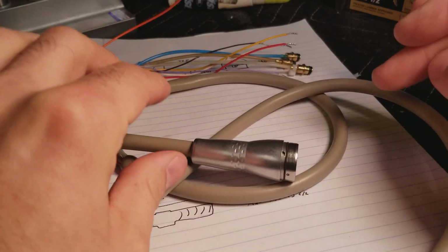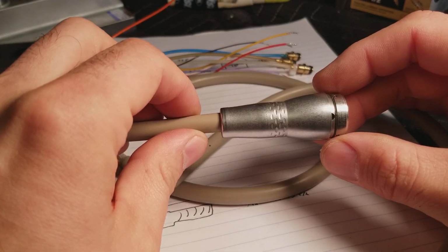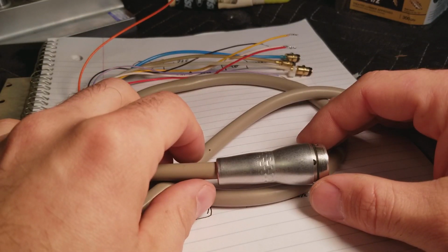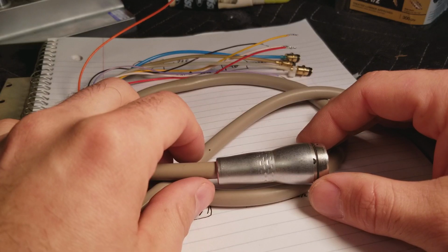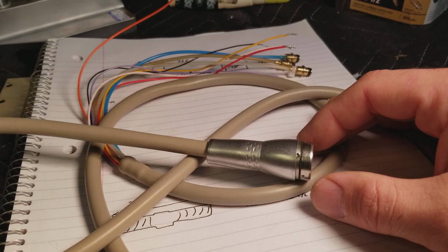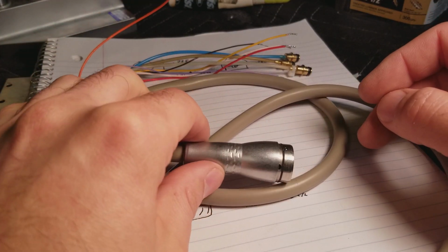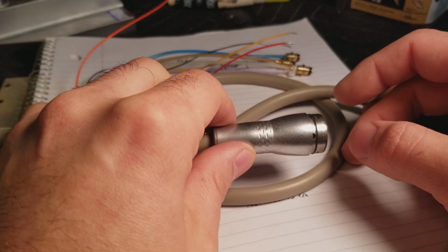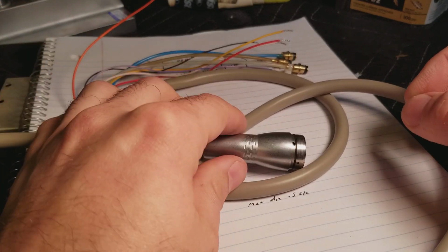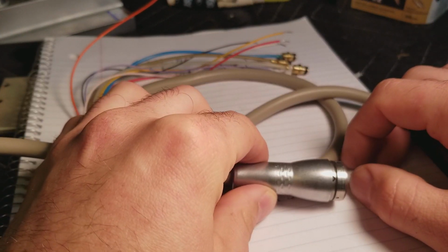This actual cable from A-dec is about $940, as I recall. That's what they quoted me. So I had 2 of these die, and at that point, after spending $1,900 or so on these, I said there's got to be a way to actually fix these. So I searched around, and like I said, I couldn't find much information. There was a cryptic video out there, but it just kind of talked about how to take this piece off the electric motor. That's very easy. You just slide back, electric motor comes off.